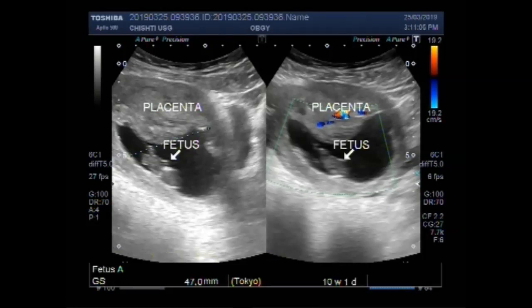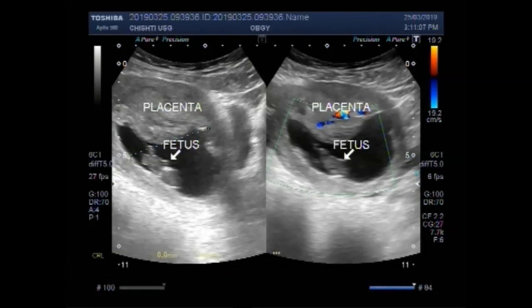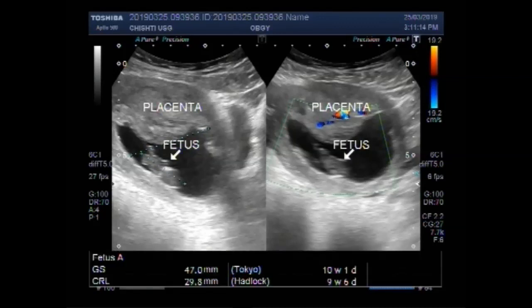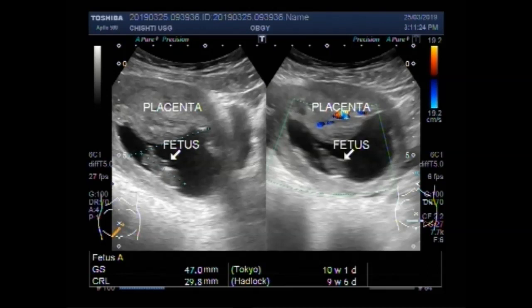The pregnancy measures about 10.1 weeks, and 9.6 weeks, by measuring the CRL — Crown-Rump Length — giving a gestational age of about 10 weeks.